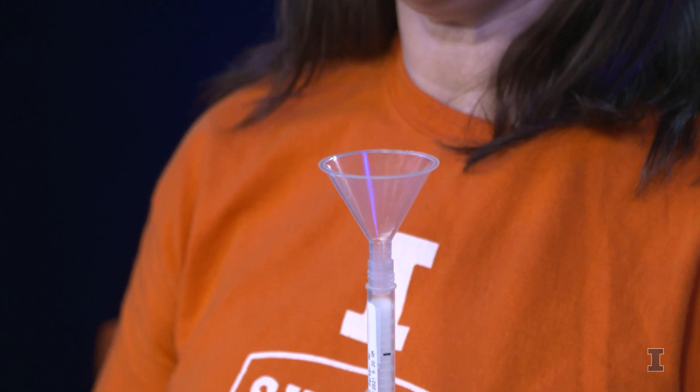Let the saliva form in your mouth. Think of your favorite food, or something sour like Sour Patch Kids or lemons.